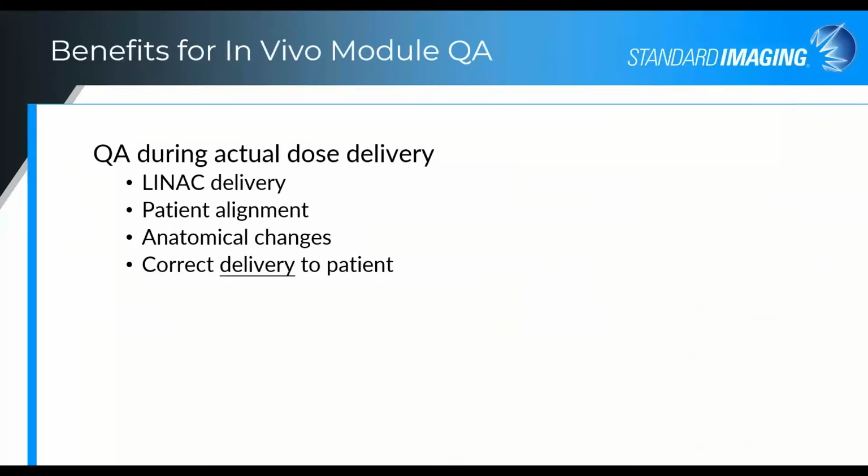So what are the benefits for in vivo module QA? You're doing QA during the actual dose delivery, so you acquire details about the LINAC delivery itself.